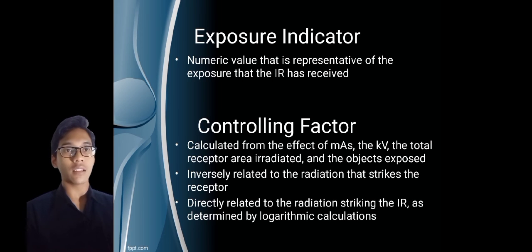And next is the exposure indicator as used by other manufacturers, which directly relates to the radiation striking the IR as determined by logarithmic calculation.